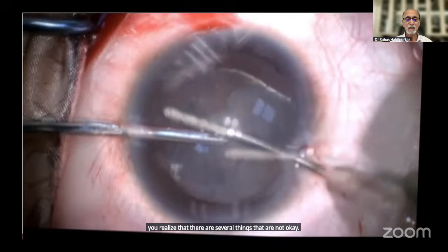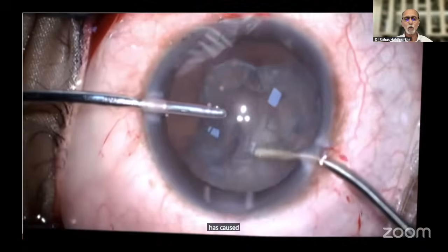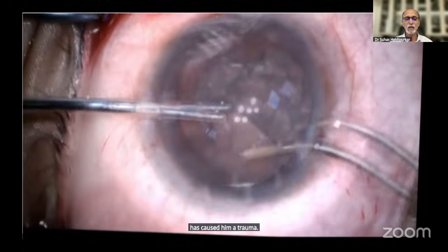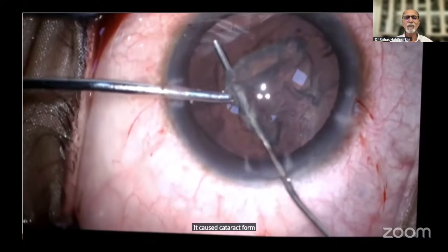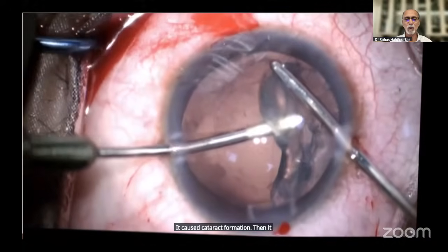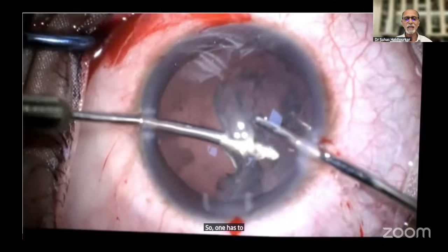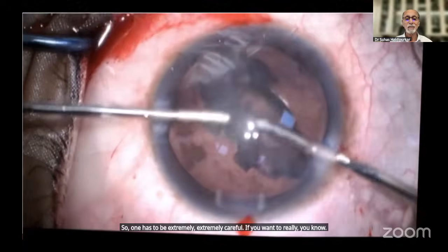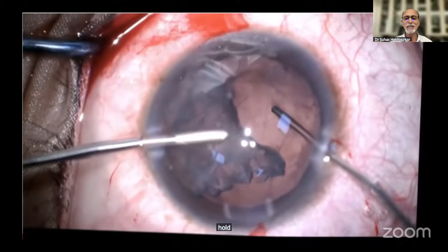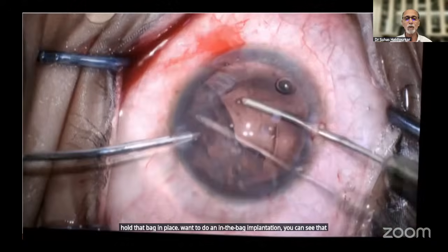A firecracker injury has caused him a trauma which caused rupture of zonules. It caused cataract formation. Then it caused posterior capsular rupture. So one has to be extremely, extremely careful if you want to hold that bag in place, want to do an in the bag implantation. You can see that posterior capsule is ruptured.